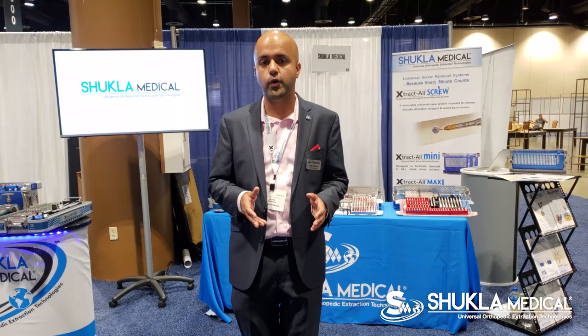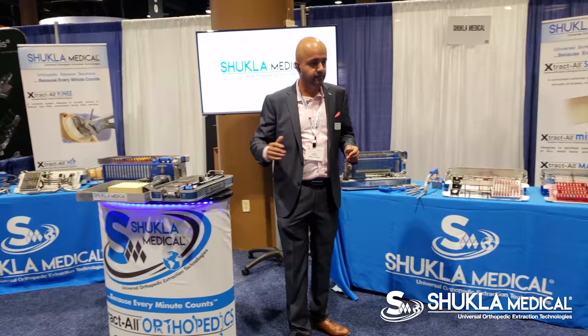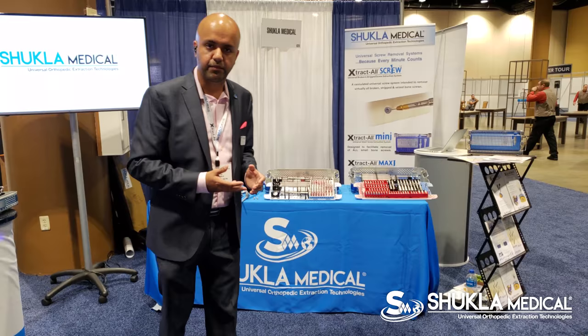At that point, they only had the WinQuist set. Since then, Shukla Medical has expanded its extractile portfolio into multiple different removal sets. We now offer a knee removal set, a hip removal set, a broken strip removal set, and even an intact screw removal set with drivers.